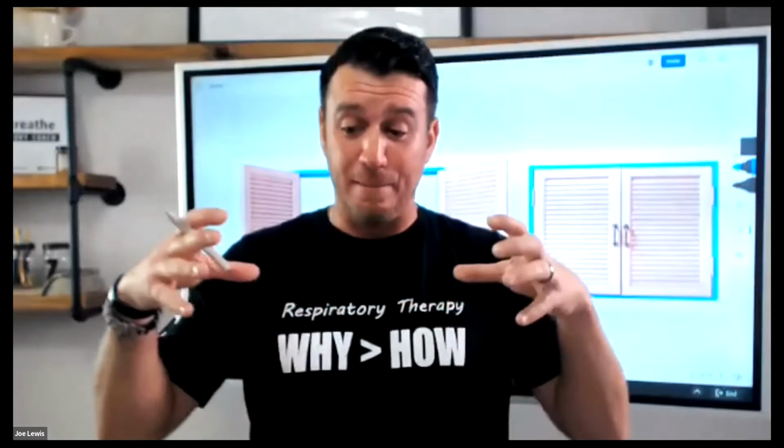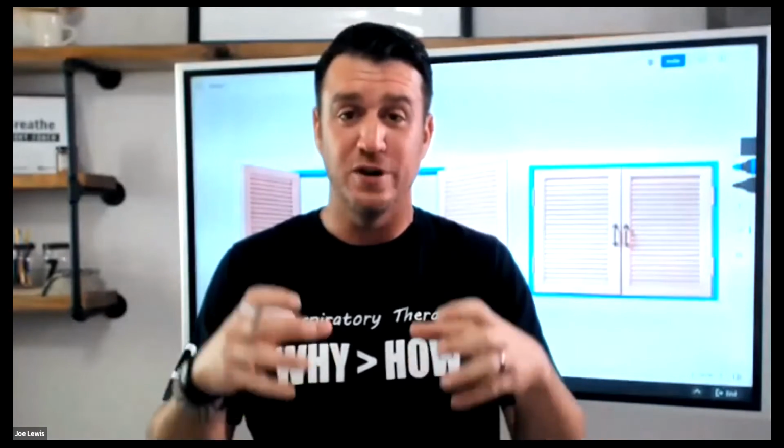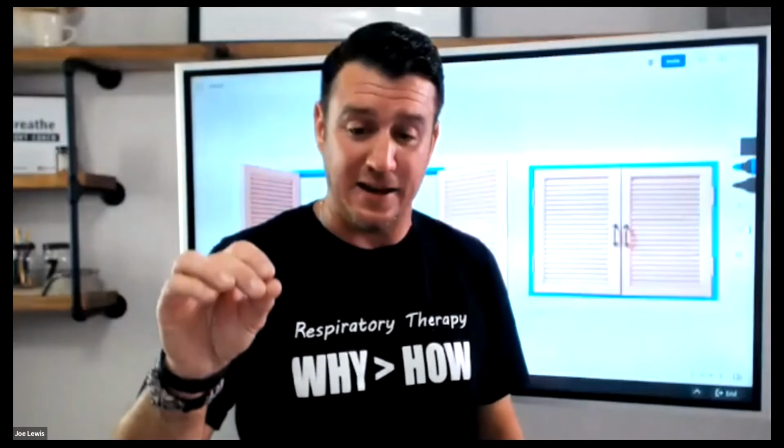And then my favorite, really cool technology that hasn't really made it to my area yet, it's called EIT. This is electrical impedance tomography. It actually gives us a beneath-the-chest-wall view of recruited alveoli. What sections are open, which ones are closed. It looks kind of similar to a CAT scan, but the imaging is different. You can actually sit there in real time and adjust your PEEP and your settings and see the effects that you are getting on your alveoli.